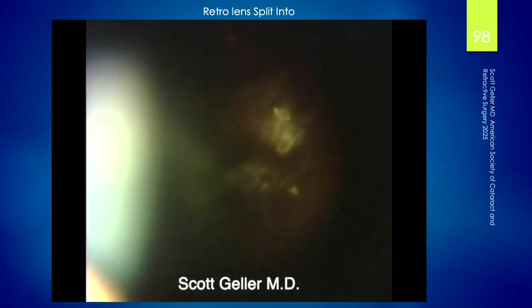and just continued the case in a day or two. There's no reason to rush this. There's no reason to get it all at once. Just tell the patient we have to continue. There we go. Fascinating.